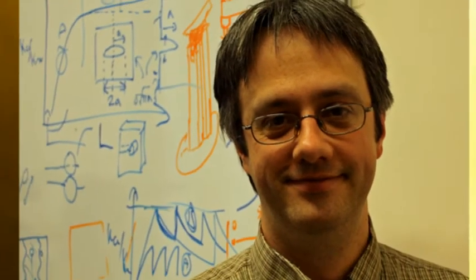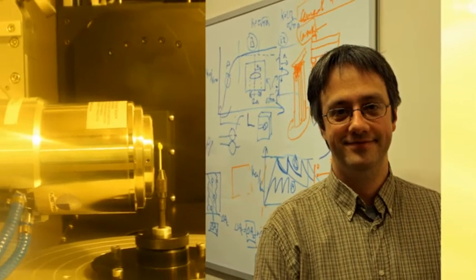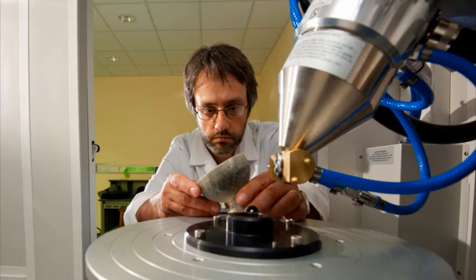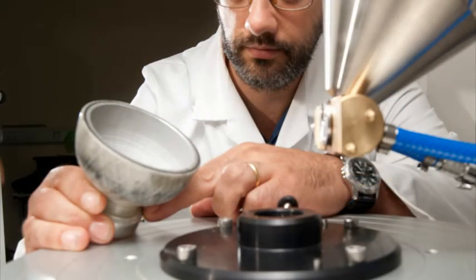The term tomography essentially means looking at something by slices through it. But the nice thing about computer tomography as we perform it is you don't actually have to cut the thing up to see those slices. And in fact, if you can take many slices of something all at once, you then get a 3D image of what is inside it, again, without cutting it up.